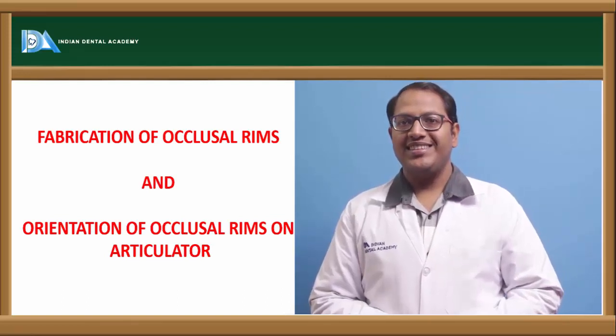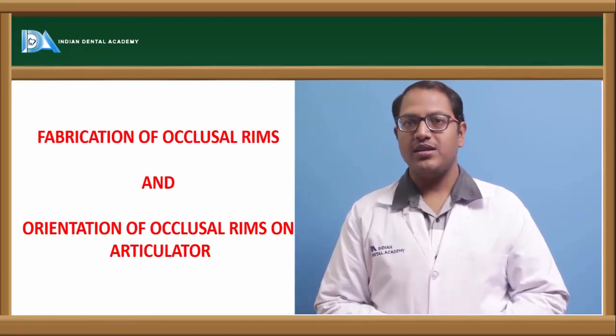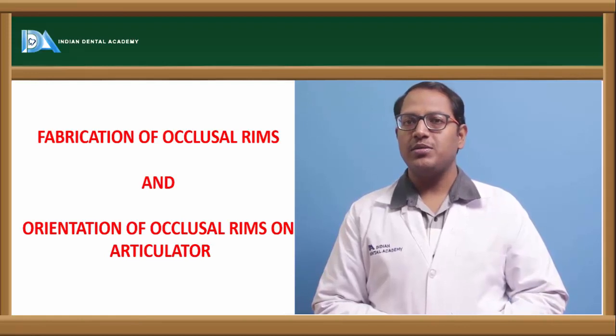Hello everyone. So now today's topic will be fabrication of occlusal rims and putting it onto an articulator. Now how does this occlusal rim come into picture?